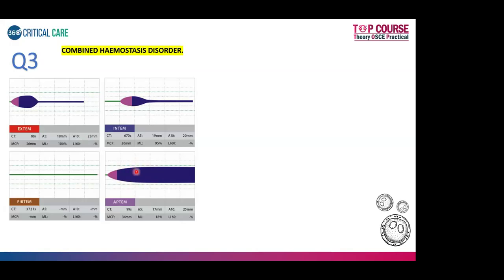When the amplitude is not coming back to normal, you have to look for issues with numbers. Start with your coagulation factors. So we have to give the tranexamic acid and the cryo and platelets, everything. So we'll go step by step here.